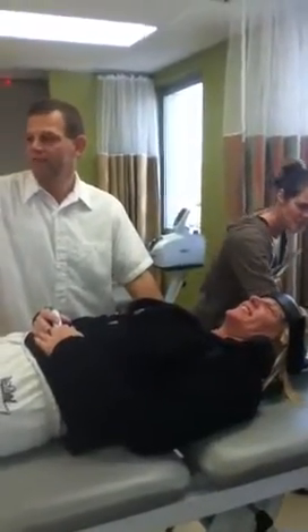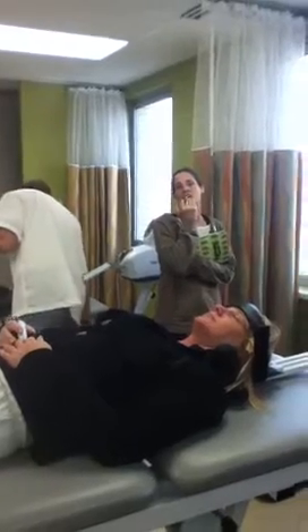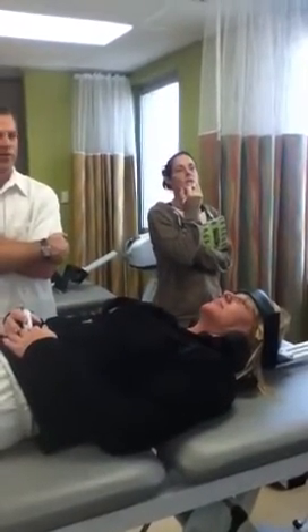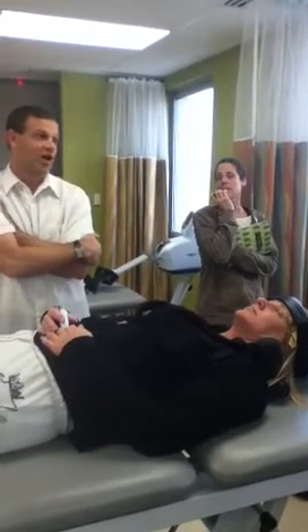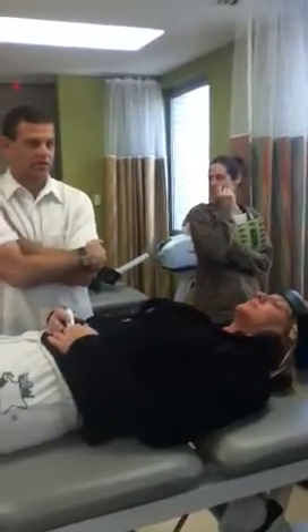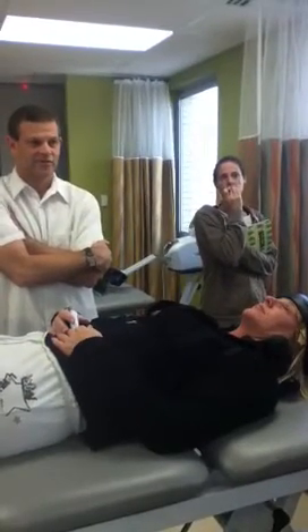Before we start our traction, we've gone over contraindications. What are our contraindications to cervical traction? Possible pregnancy for women. Any claustrophobia. Joint instability, or if you were told not to move. If there's an acute flare-up or inflammation that just happened. GERD is a precaution — the person may not be able to lay flat for 10 to 15 minutes. Recent spinal fusion. Flu-like symptoms or feeling bad that particular day. And the vertebral artery occlusion test.